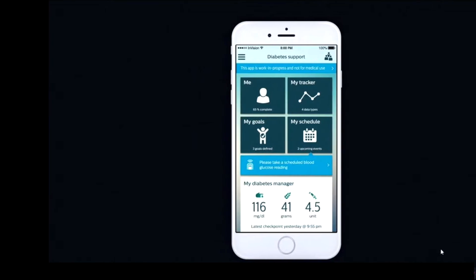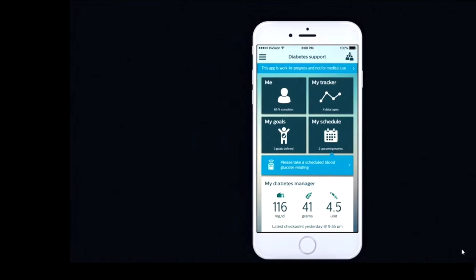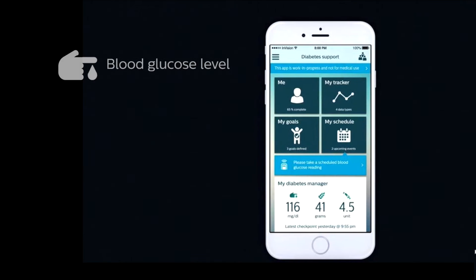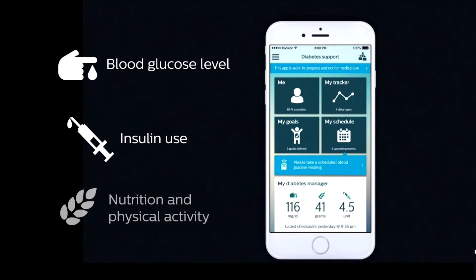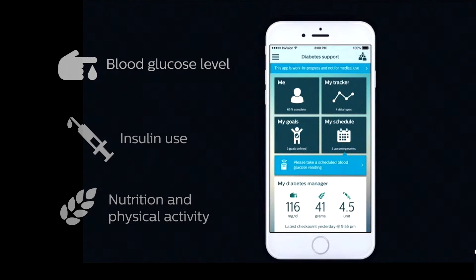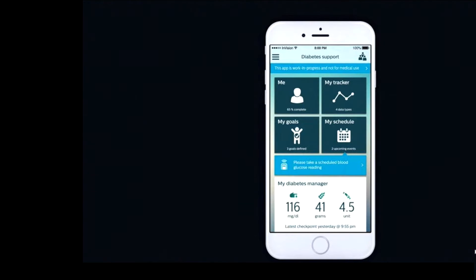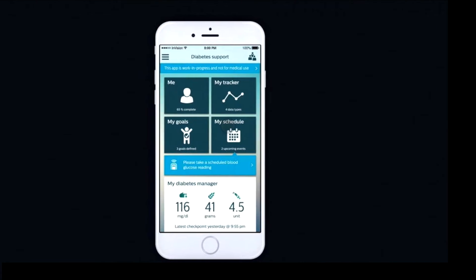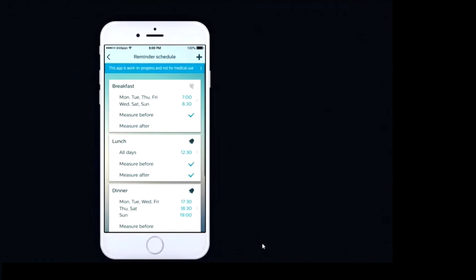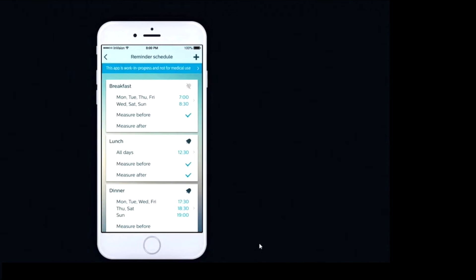Through the dashboard, people with diabetes can track their blood glucose levels, insulin use, nutrition, physical activity, mood, and other parameters, and get data-driven feedback, coaching guidance, and view their trends, whether they're at home or on the go.